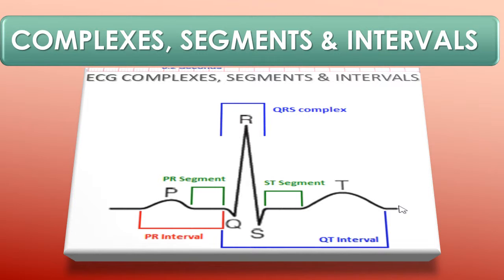An abnormal U wave signals hypokalemia or an electrolyte imbalance and should not be mistaken for a P wave. You want to notify a doctor, you want to check potassium levels, and in your textbook on page 716 or thereabout is a picture that I have referenced in your notes.